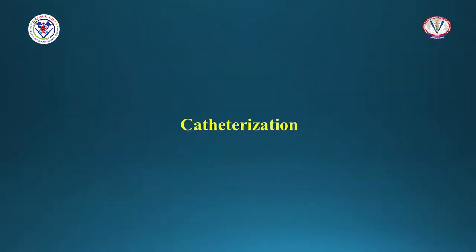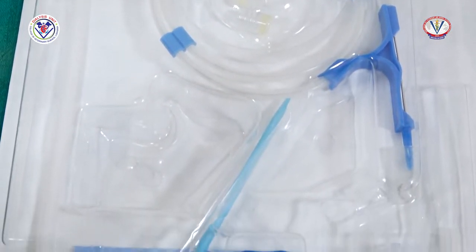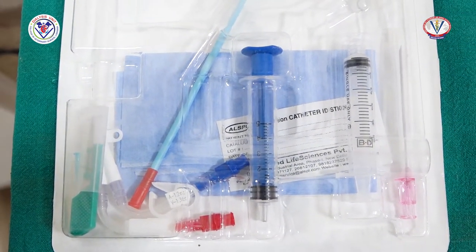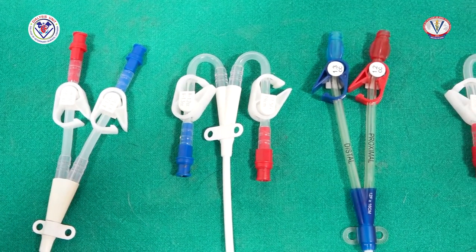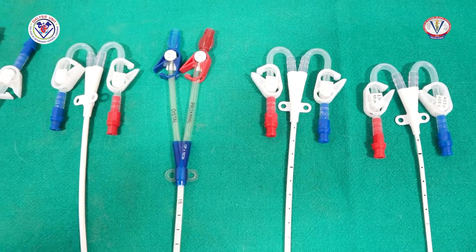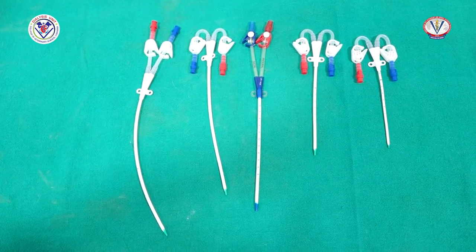dialysis. Catheterization. To carry out efficient dialysis, a dedicated dialysis catheter, the double lumen catheter, also known as DLC, is used, which allows simultaneous removal and return of blood. The size and type of catheter depends on patient size and intended placement time. Temporary catheters may function for up to 4 weeks, whereas permanent catheters can function for an extended period of time.